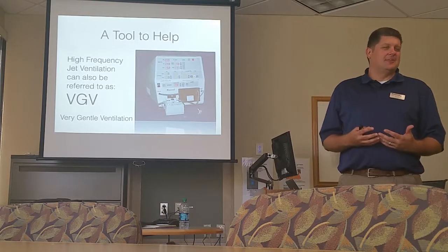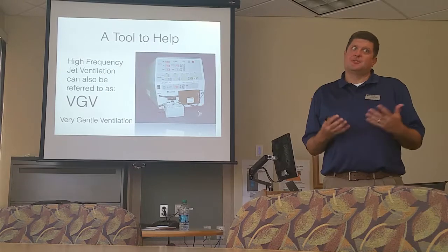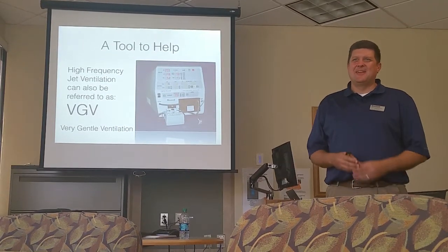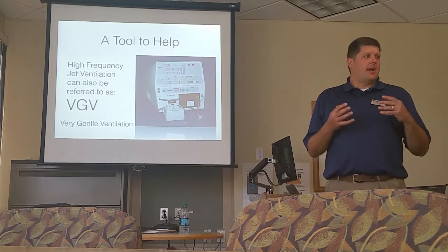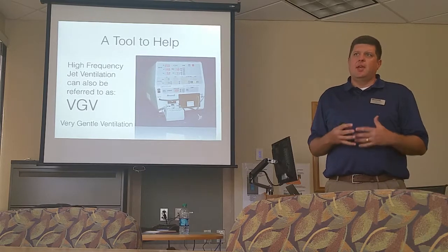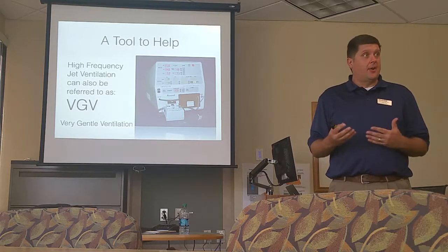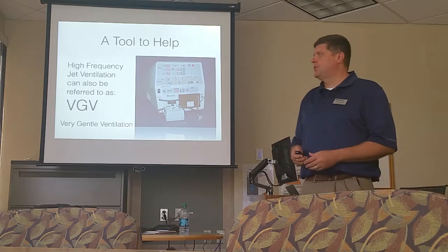But these ventilators were invented to prevent lung injury, not just treat it. Historically, we treat it, right? We use rescue mode type stuff. But I honestly believe the more comfortable and confident we are, the more we learn about these machines, the less afraid we are to get them started earlier rather than later. And that's always a good pattern for success: start it sooner rather than later.